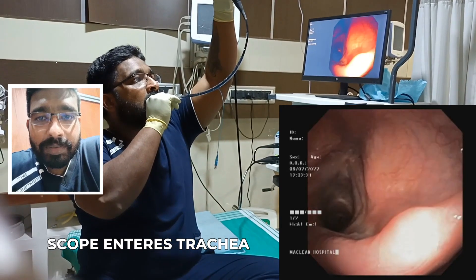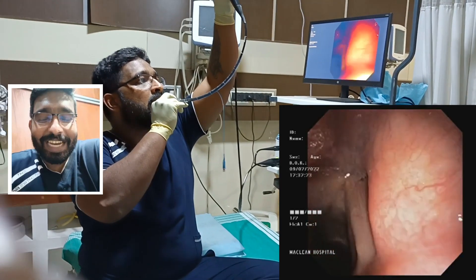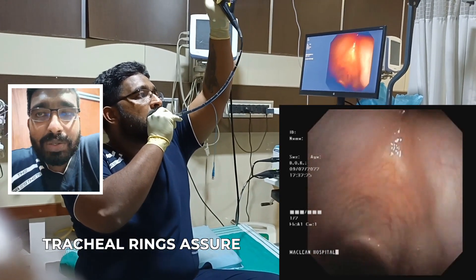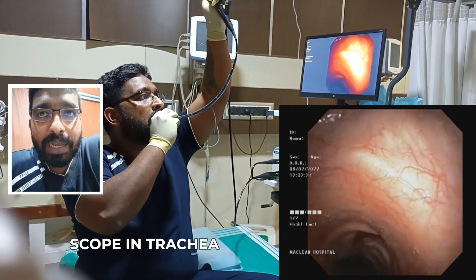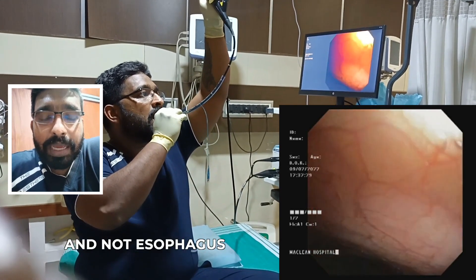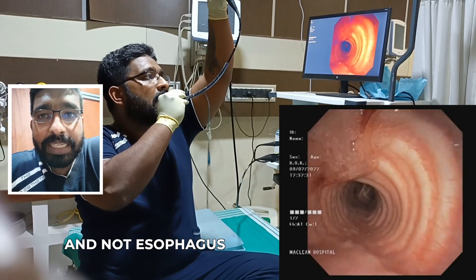What made you intubate yourself with a fiber optic scope? I just want to show people how video bronchoscopy can make intubation easier.